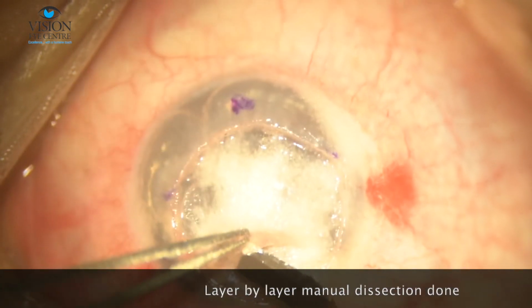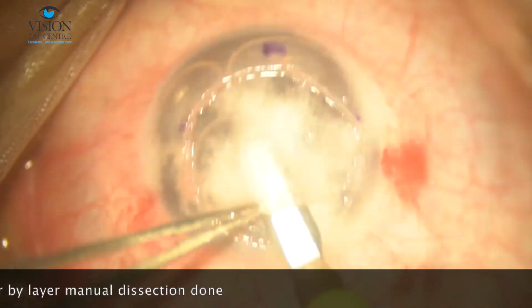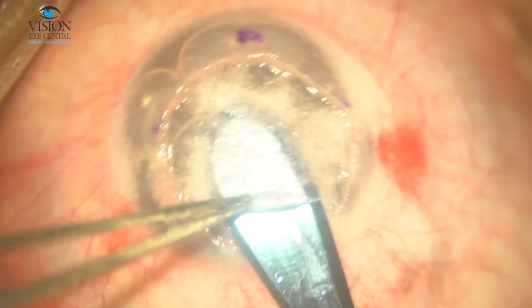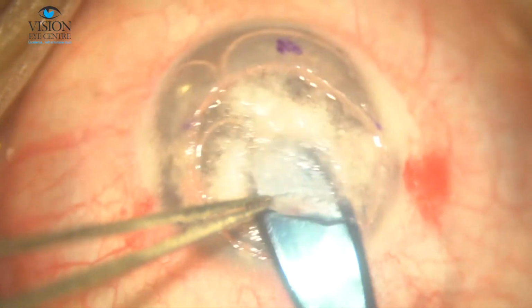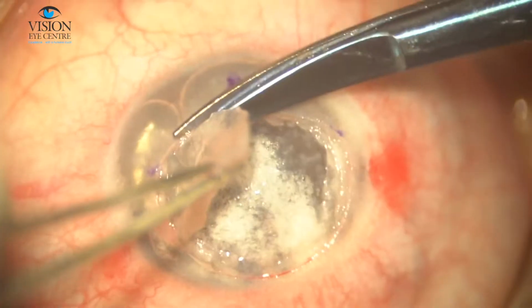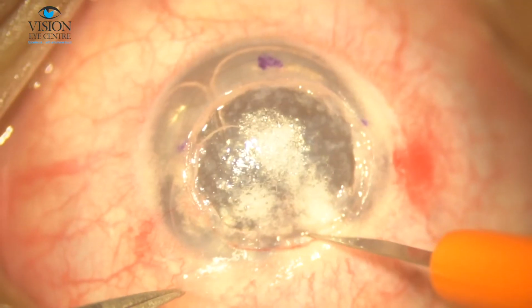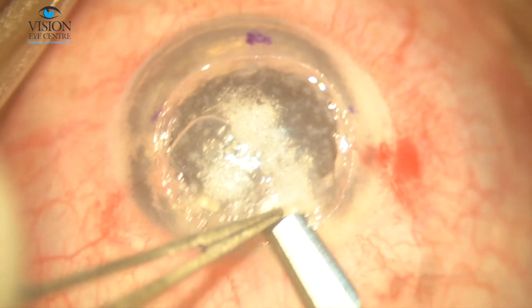So a combination of 15-degree blade, crescent knife, and various manual dissectors are used to keep going layer by layer and to go on posteriorly up till we reach the clear cornea. This is the case of macular dystrophy, so there is extensive involvement of the stroma right up till the predesmetic space. So it is extremely important to go quite deep in these cases, particularly.